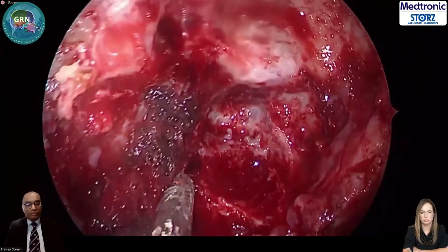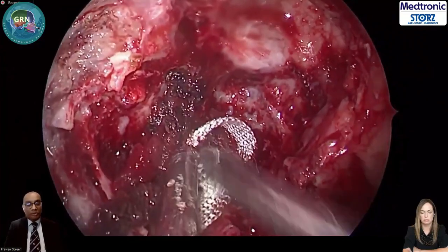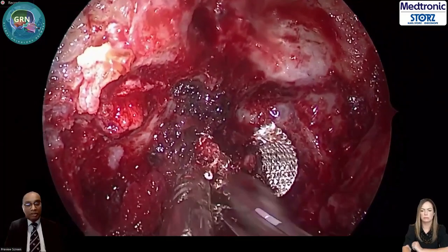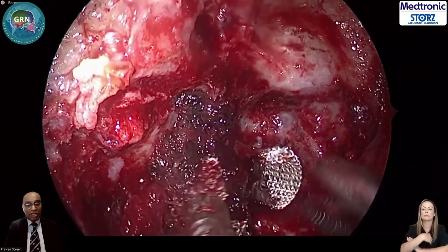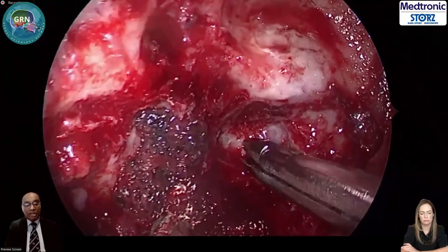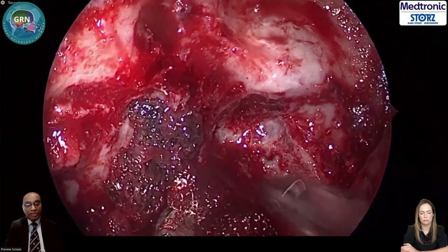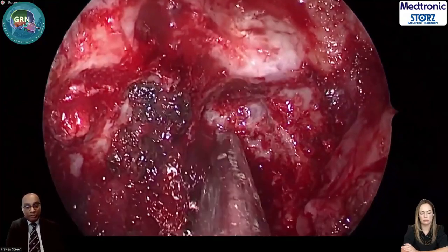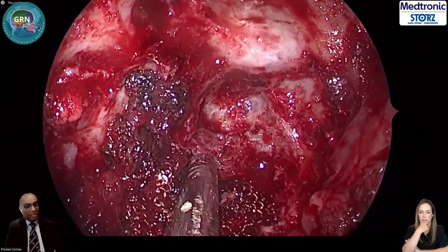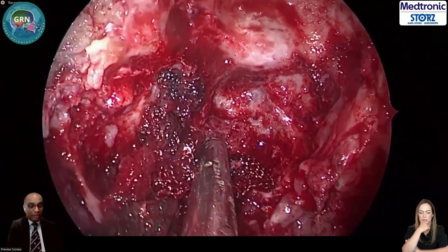No, it's okay. It's okay. That's fine. Wait, I'll take it off. Wait. So once you're completed, we'll come back to you, Dr. Jankiram, and it will be great to sum up as well towards the end of the case and end of the day about the whole session and some pearls of your tips for our delegates. Have you got the WhatsApp message of the carotid, the complete carotid? Yes. Yeah. Surgicel.